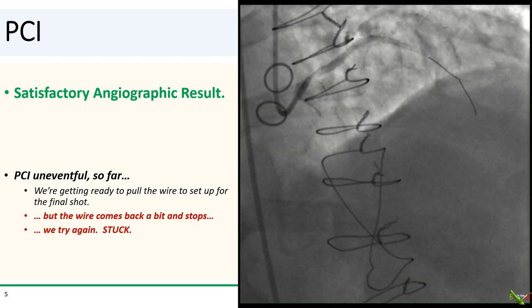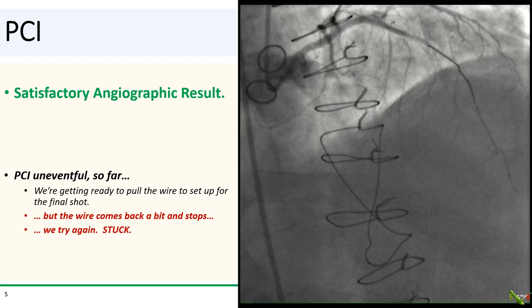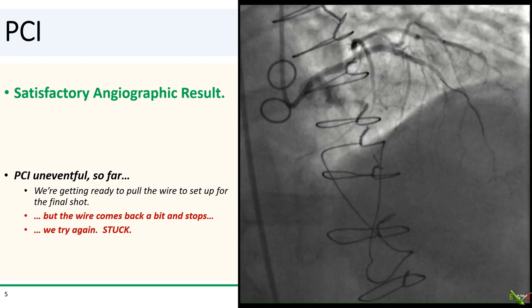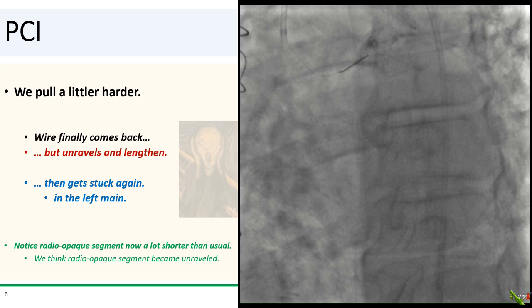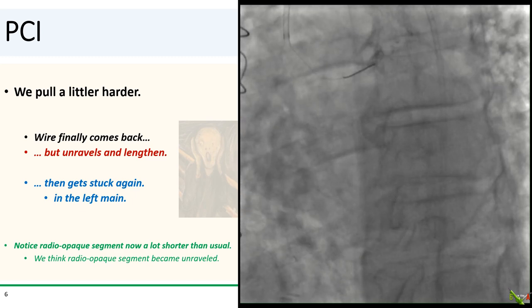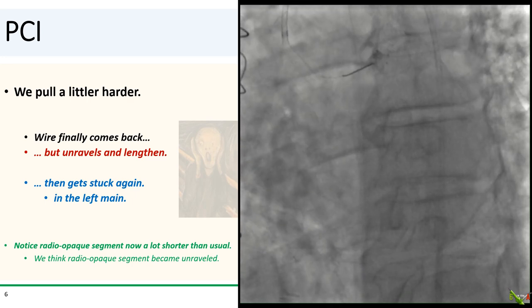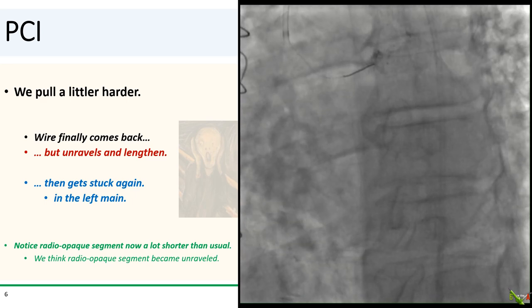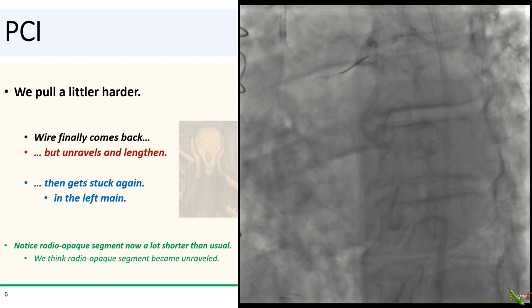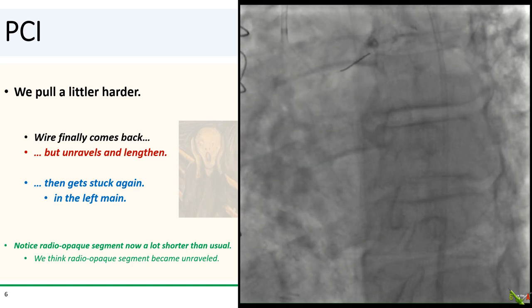PCI was fairly uneventful so far, and we were getting ready to pull the wire and set up for our final shot, but the wire comes back a bit and then stops. We try pulling again — the wire seems stuck. We pulled a little bit harder; the wire finally comes back, but then appears to unravel and lengthen, and then it gets stuck again, this time in the left main. Notice how the radio-opaque segment of the wire appears a lot shorter than usual. In retrospect, looking back at the previous angiograms, it's possible that there was either a kink or a defect in the radio-opaque segment that then became stuck in a freshly stented segment and then unraveled as we pulled.